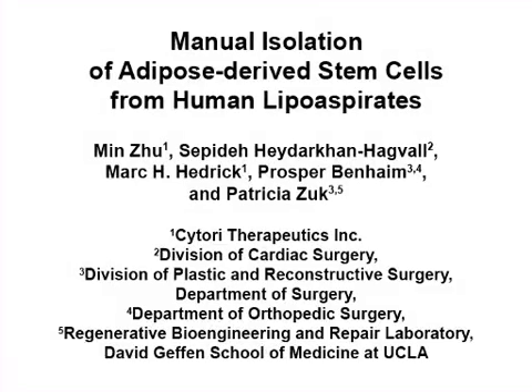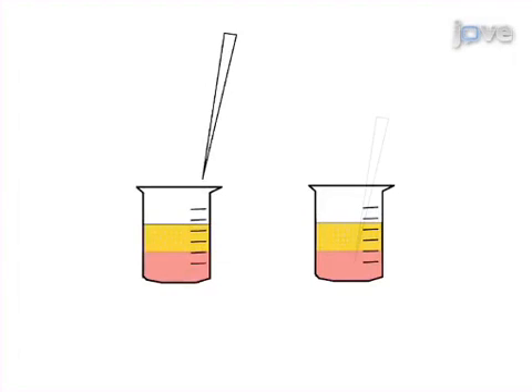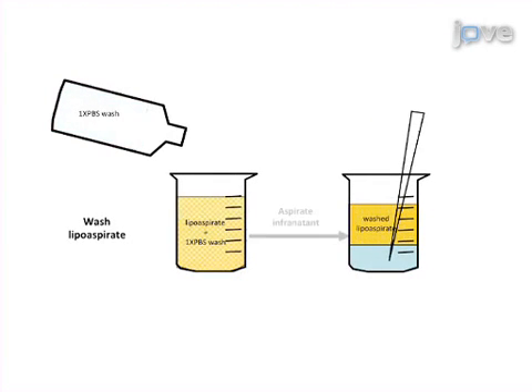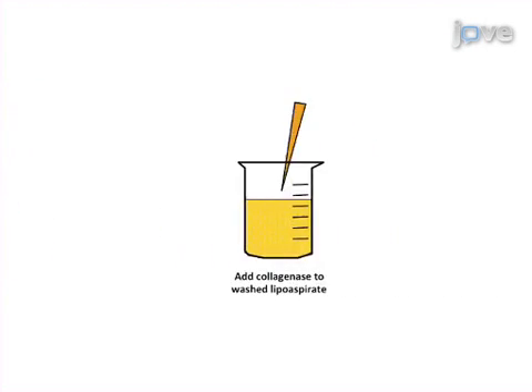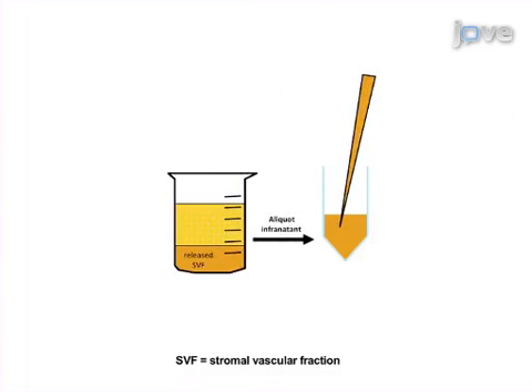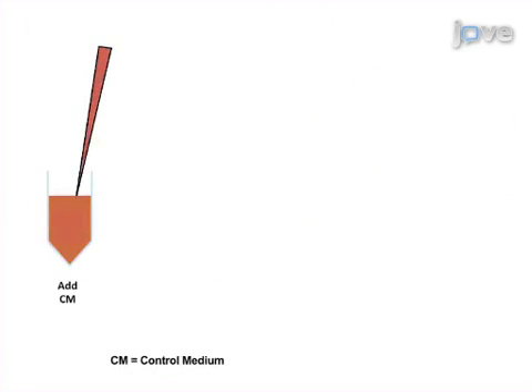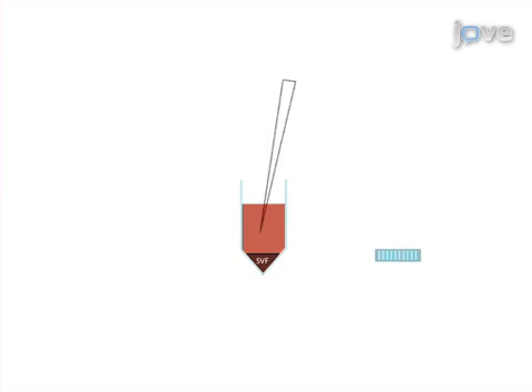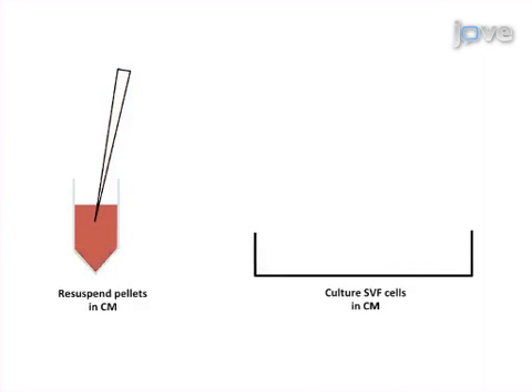The overall goal of this procedure is to isolate adipose-derived stem cells from fat obtained in the form of a lipoaspirate. This is accomplished by first removing the surgical saline solution and washing the aspirate of contaminating red blood cells. The second step is to release the stem cells via enzymatic digestion of the washed lipoaspirate with collagenase. Next, the released cells in the form of a stromal vascular fraction or SVF are collected by centrifugation. The final step is to remove the supernatant and plate the SVF cells for selection and culture of the adherent ASCs.